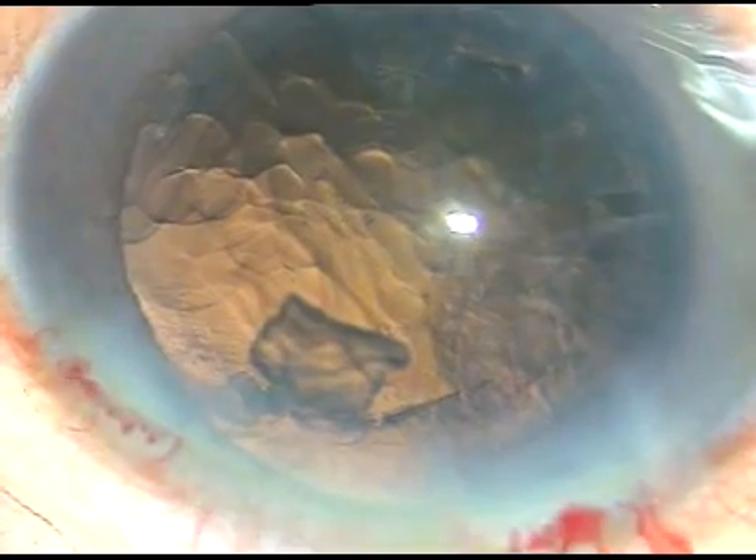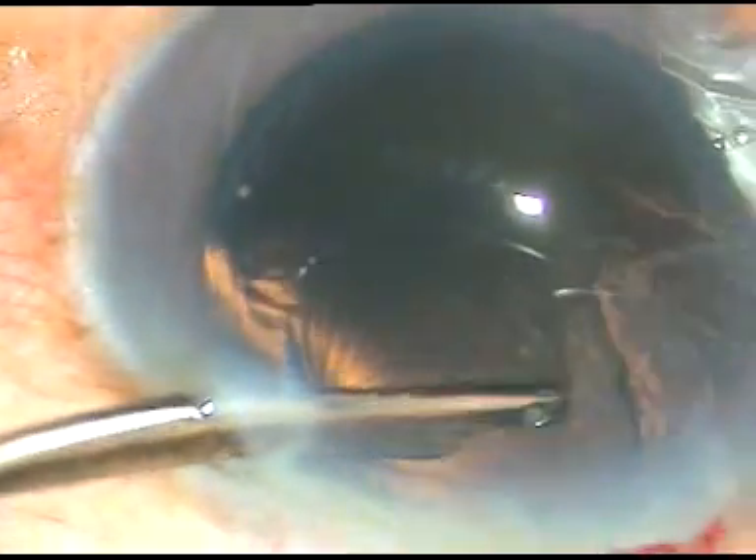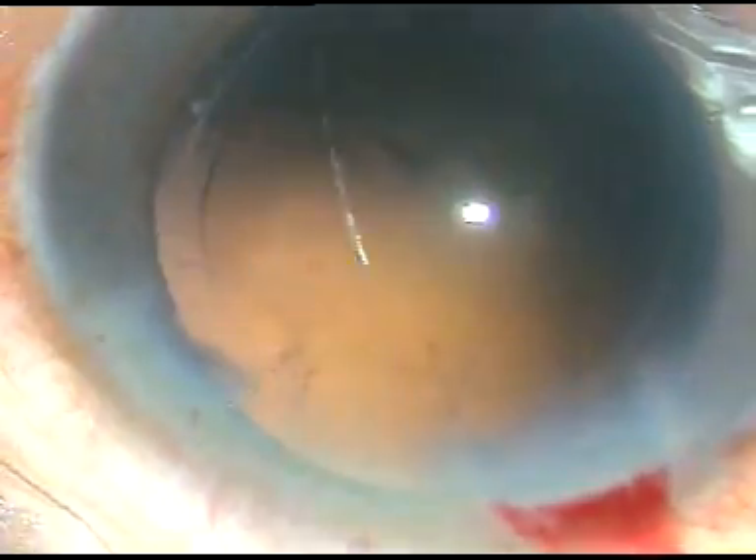The case is almost done. Now in this case, since there is only one side port, I am going to use a Simcoe cannula to remove the cortical matter. I use a 23-gauge direct Simcoe cannula — it's a beautiful instrument, attached to a 10 cc glass syringe. The nuclear piece which was there should be removed first, otherwise it can get lost underneath the iris. Most of the cortical matter has been removed. Now the sub-incisional cortex is removed by going through the side port — the side port is a little larger than 1 millimeter, probably 1.2 millimeter. The cortical cleanup has been done.